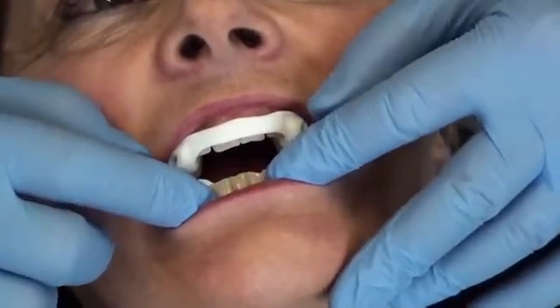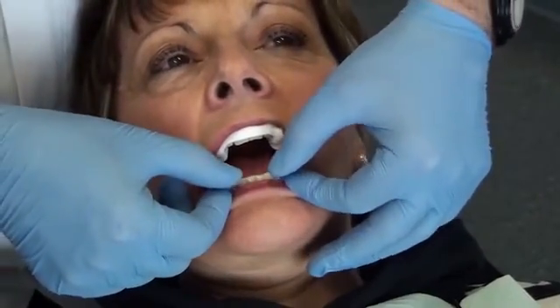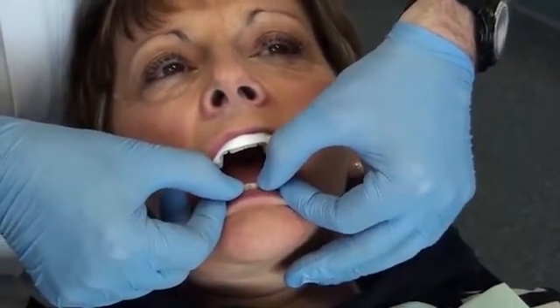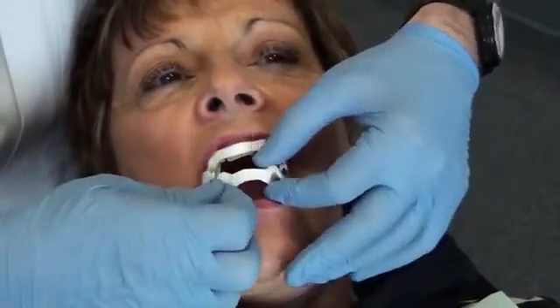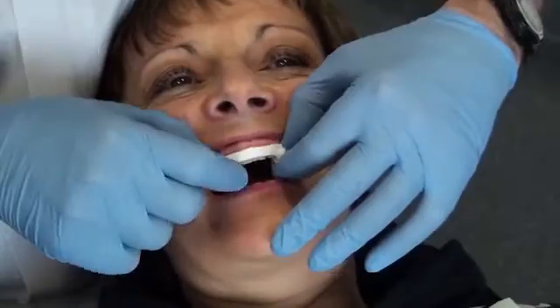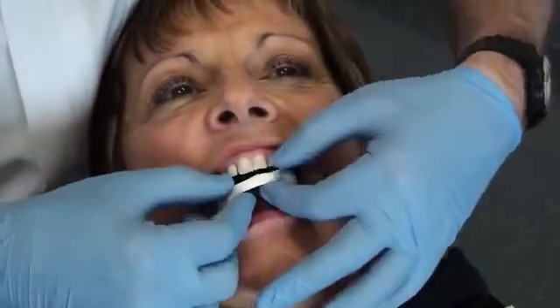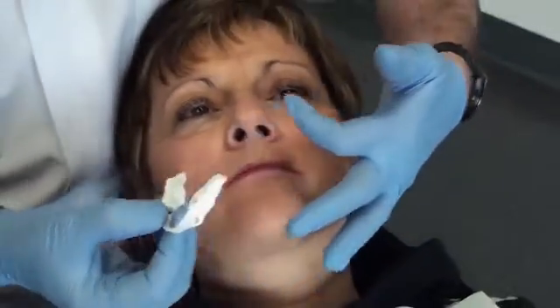The patient opens her mouth. I will remove the lower part to check if it is very tight — there is quite a good resistance when removed. For the upper part, I place my fingers just above the canine teeth and remove it in a similar manner.